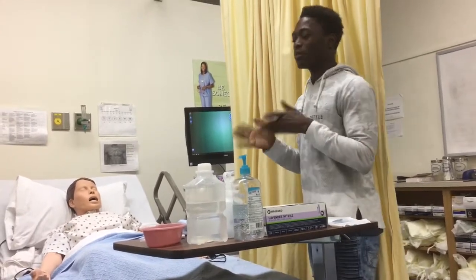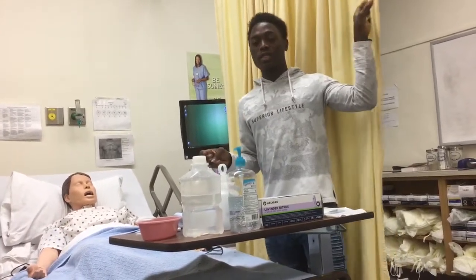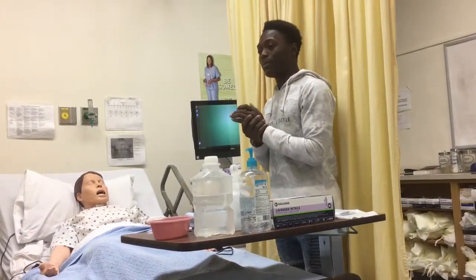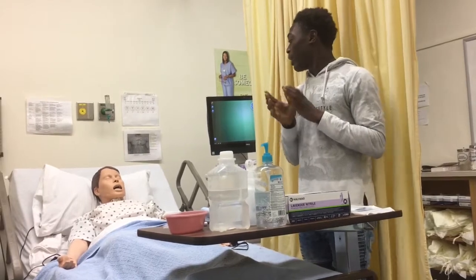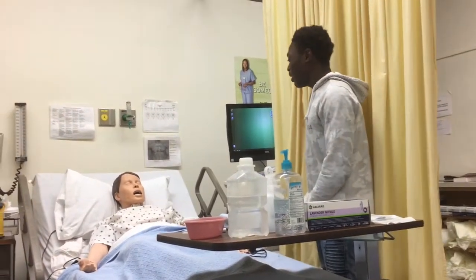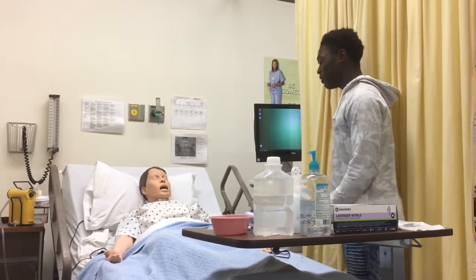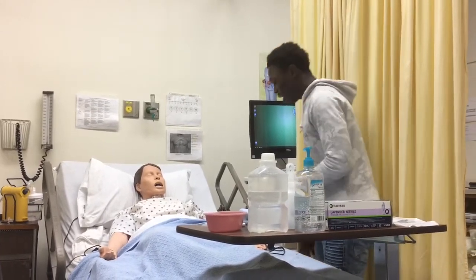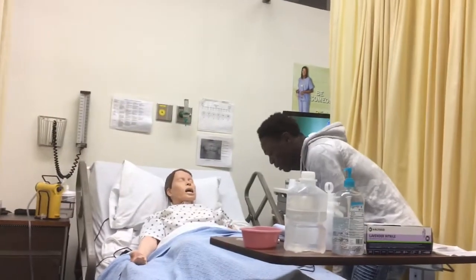So first of all, when you come in, you want to provide the patient with privacy, wash your hands, and identify the patient by name and date of birth. Like, hi, how are you? I'm Prince. I'm a nursing student from Mansfield University. Can you please tell me your name and date of birth? Oh, that's nice. Okay, I'm just confirming that. Look at the patient wristband.